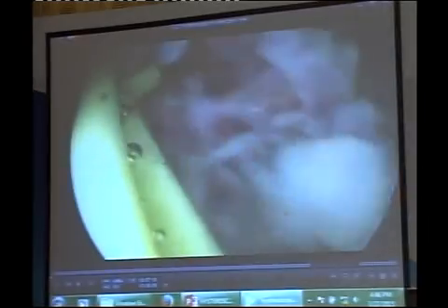As you can see in this video, all the small bleeding vessels at the bed of the myoma can be effectively coagulated with the desiccation mode and the coagulation. In order to visualize the bleeding points more efficiently, the intrauterine pressure is momentarily reduced so that the bleeding points can be seen clearly.